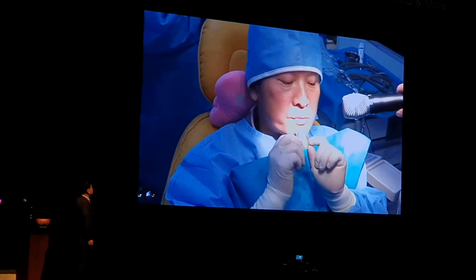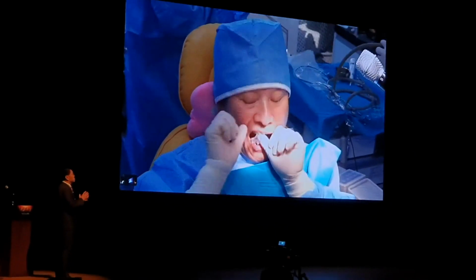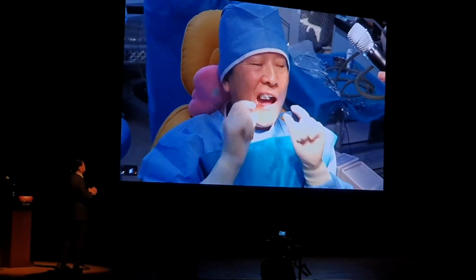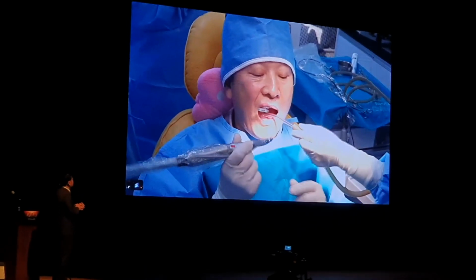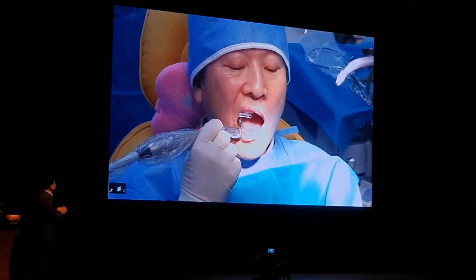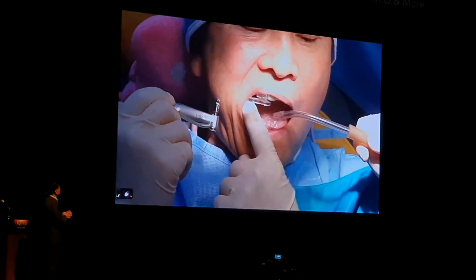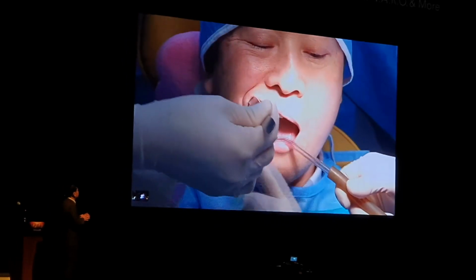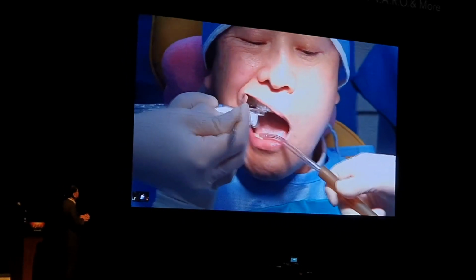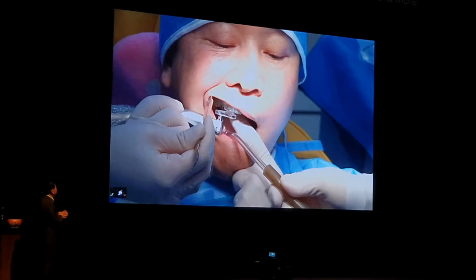First, tissue punch, please. The first step is using the tissue punch for removing the soft tissue. Dr. Ho himself, wearing the guide we just made, the fixed VARO guide, is performing the tissue punch.